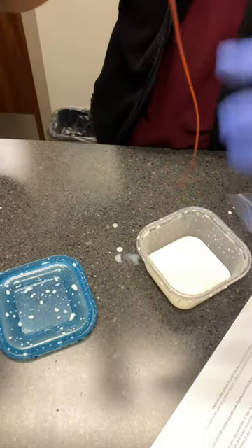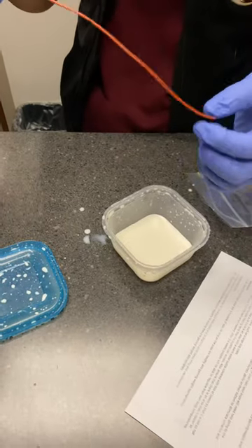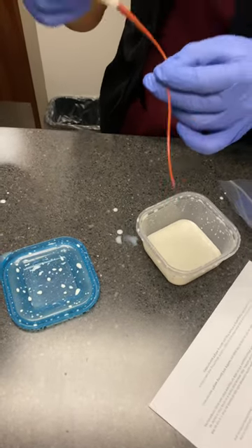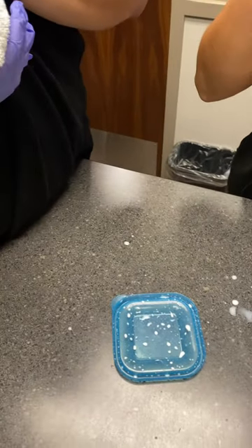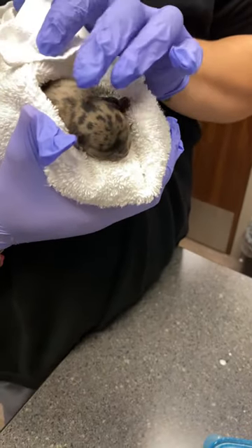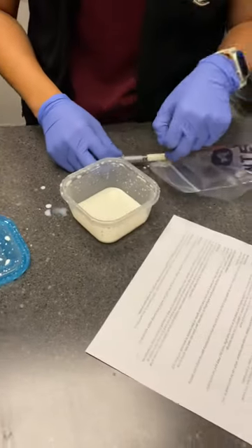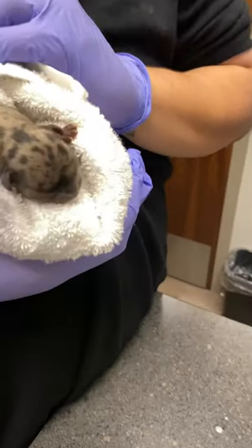Just rinse it, make sure there are no clumps and it's clean. As she gets older it might move, but for the next two weeks this measurement should be okay. This is only for two weeks. Do it every two hours, and then at three to four weeks you can try wet puppy food — you'll start to see some puppy teeth growing.